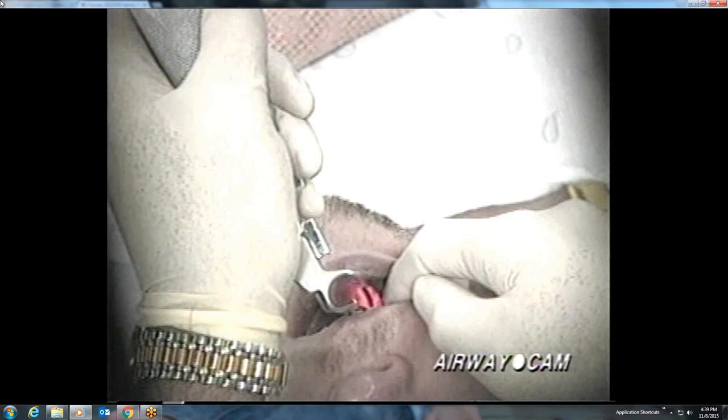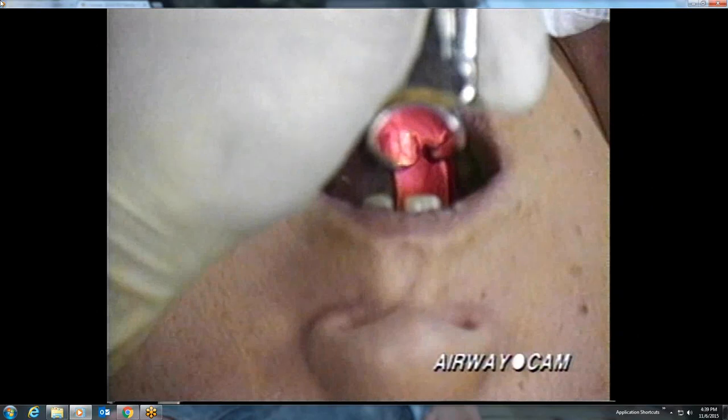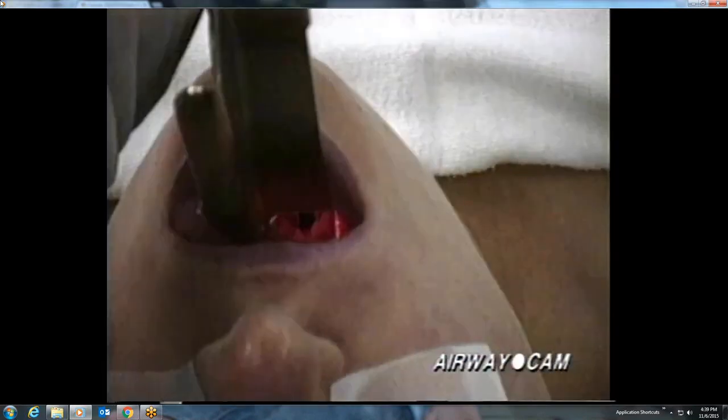The glottic opening widens during inspiration. Depending on the muscular tone of the patient and on the amount of traction on the laryngoscope, the glottic opening during laryngoscopy may be a small vertical slit or have a wide rhomboid shape. Following visualization of the posterior pharynx, one of 2 critical landmarks should come into view, either the epiglottis, shown here, or the posterior cartilages, as shown in this patient.